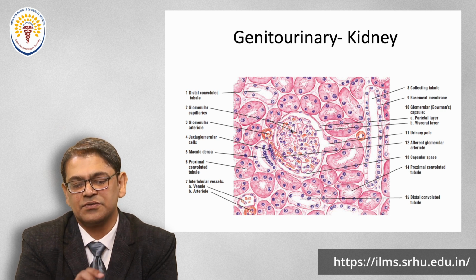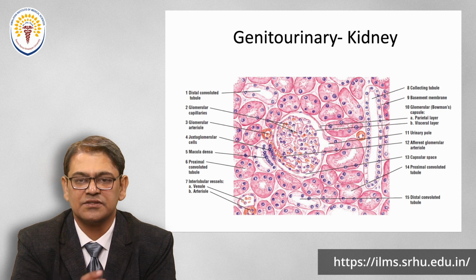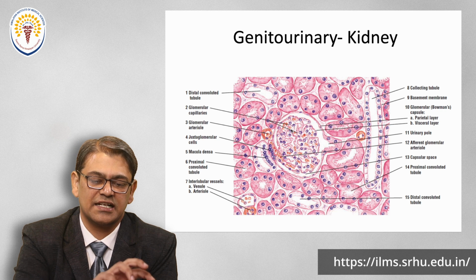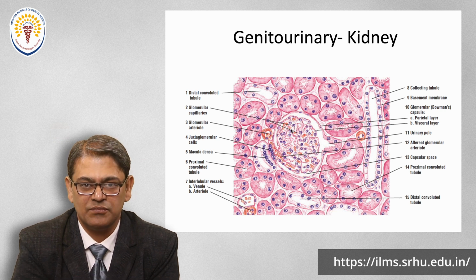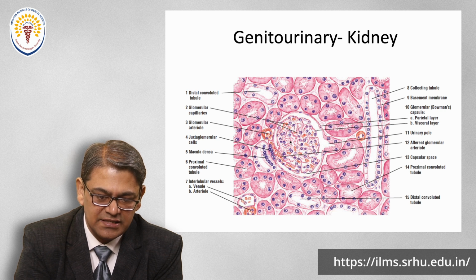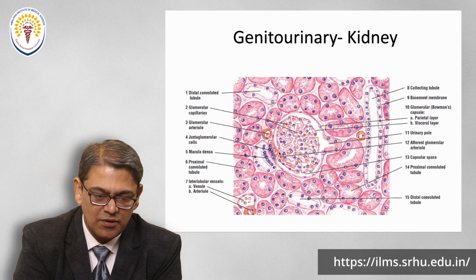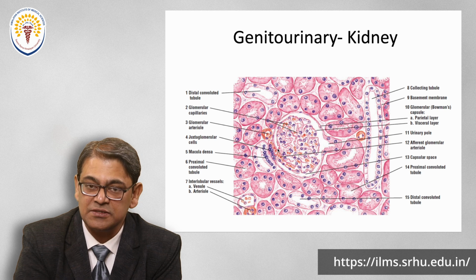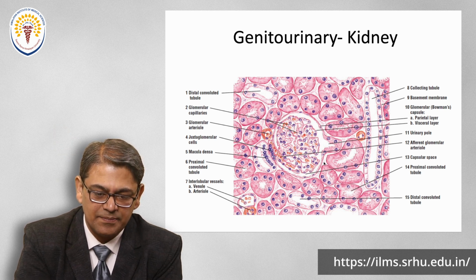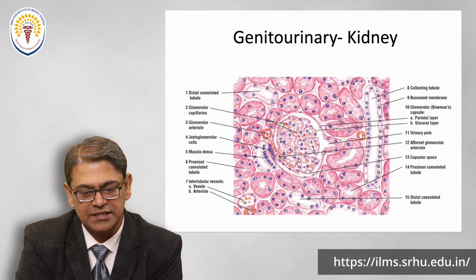First, going through this video, please also refer to our earlier videos on simple histology so that you have an idea of simple histology and then combine them to make it more understandable here. Here we see the various blood vessels. Old students must know how a blood vessel looks under the microscope. This is the parietal layer, and in the parietal layer we see the squamous epithelium.